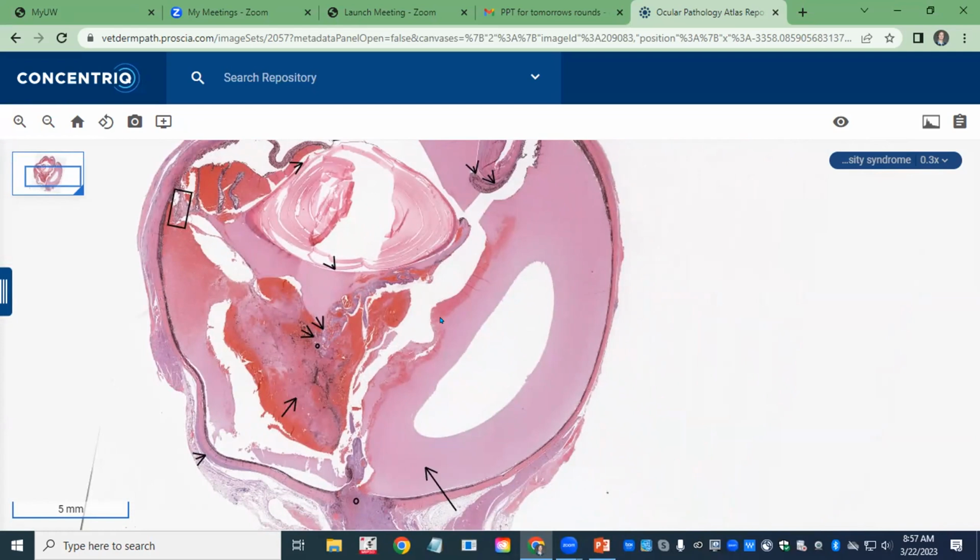Also, you carried out... Go ahead. Talk about vessels. Yeah, I have a couple more points to add for hyperviscosity syndrome. First of all, if you're trying to decide between hyperviscosity syndrome and systemic hypertension, look for abnormal vessels, like hypertrophied tunica media, or atherosclerosis. If you find vascular lesions, chances are it's not going to be hyperviscosity syndrome, but instead systemic hypertension related stuff.